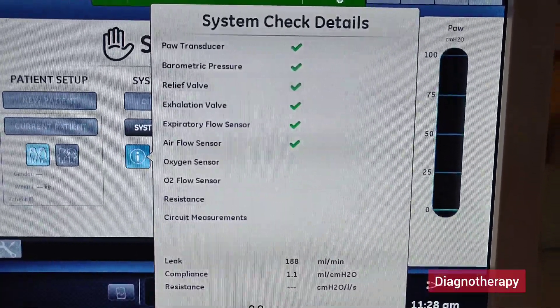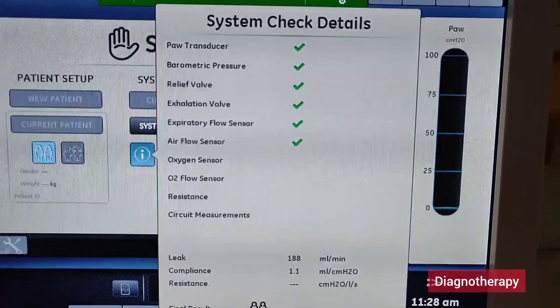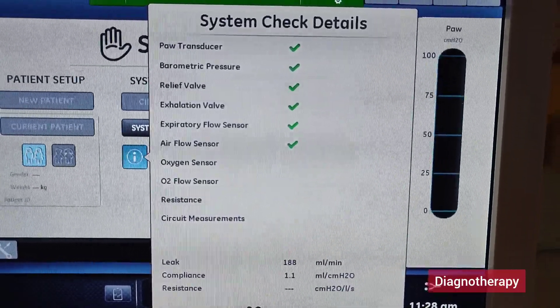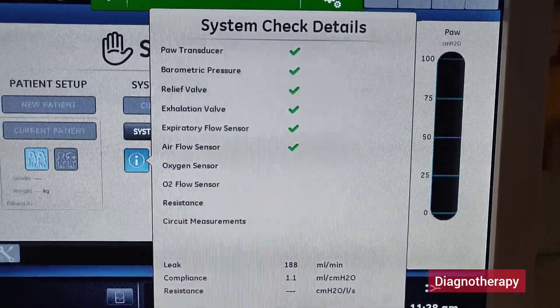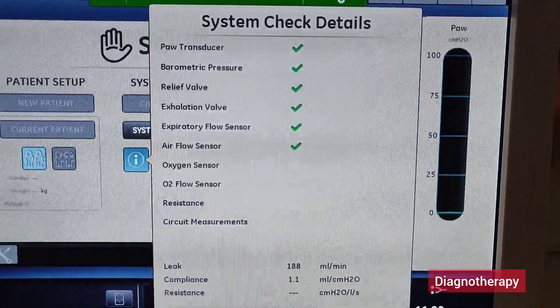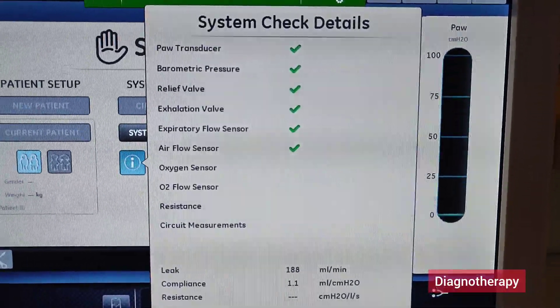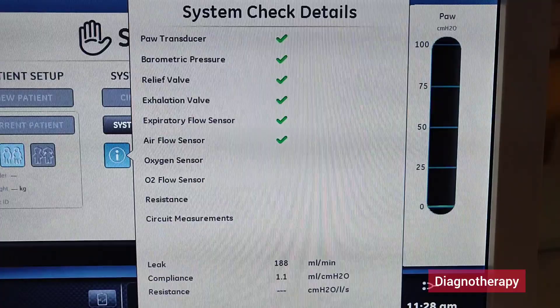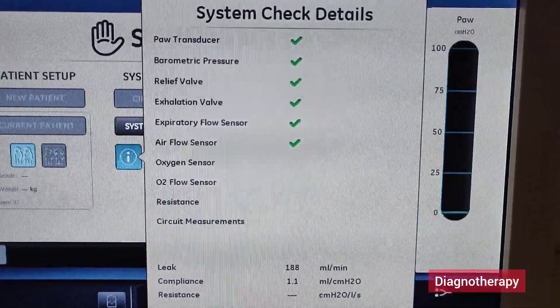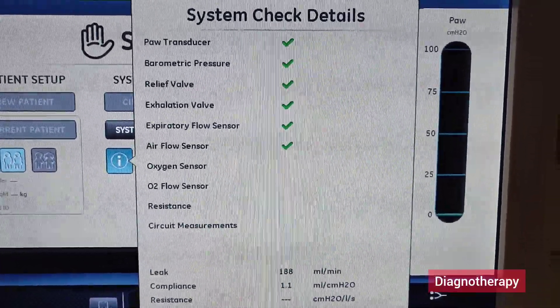Then similarly it will check the air flow sensor. These two parameters are checked simultaneously — whenever the flow sensor is passed, the air flow sensor values are also detected by the ventilator. After that it will go to the oxygen sensor to check how much the oxygen content is per breath. Whatever amount of breath is given, it checks how much oxygen is in that breath — what value was set on the ventilator and what value is actually delivered to the patient.